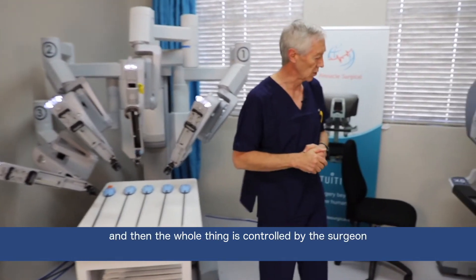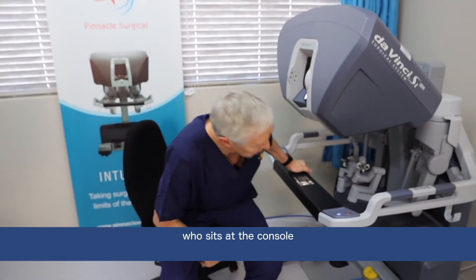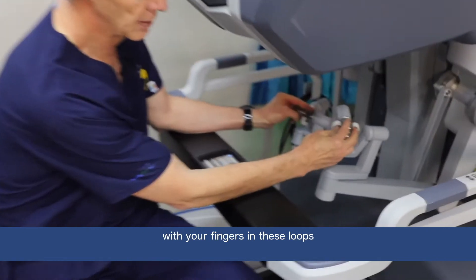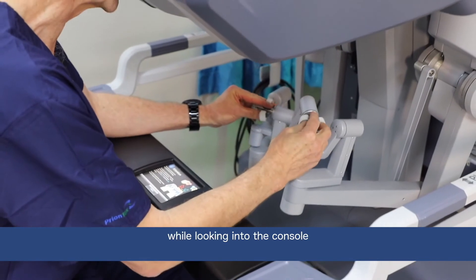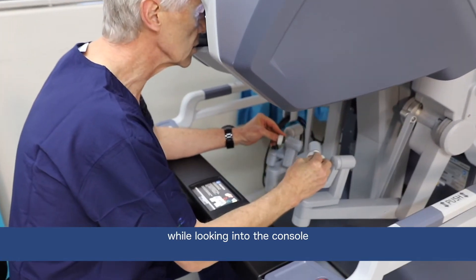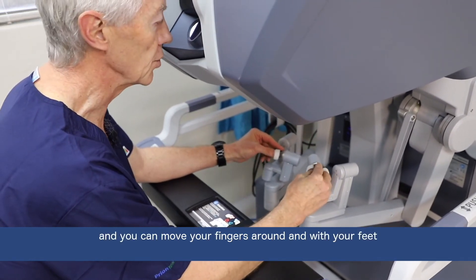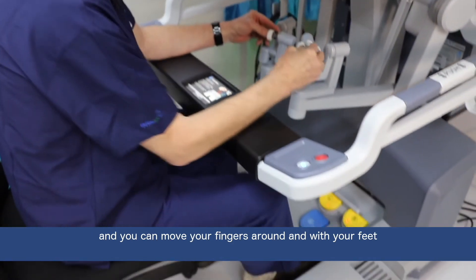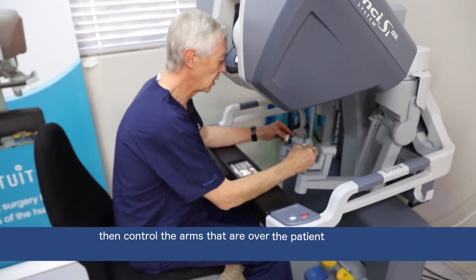Everything is controlled by the surgeon, who sits at the console over here. With your fingers in these loops, and as you move your fingers while looking through the scope into the console, you can move the instruments with your fingers and with your feet to control the arms that are moving on the patient.